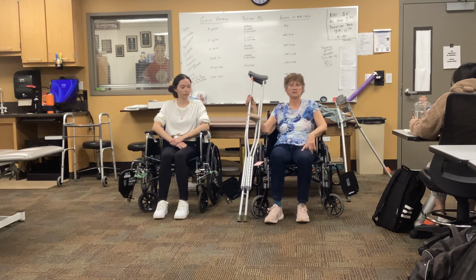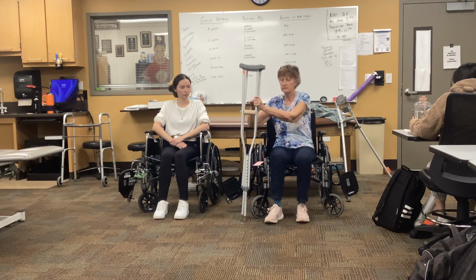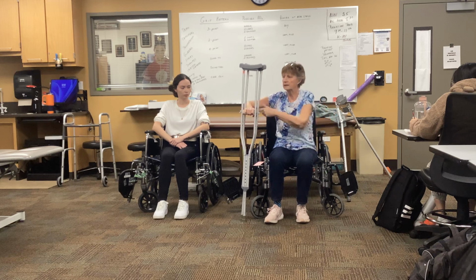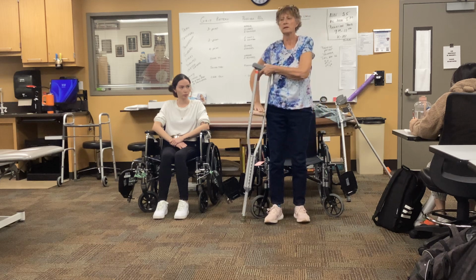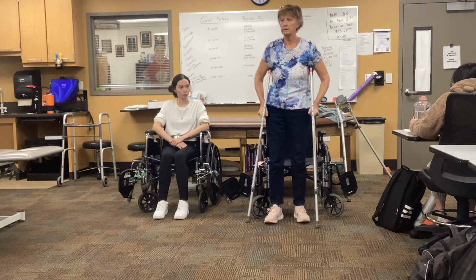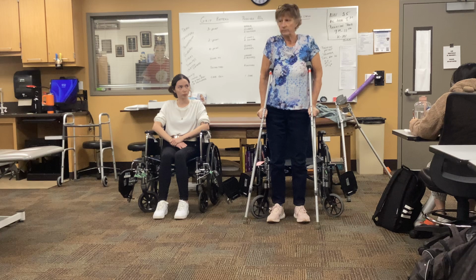Okay. So I'm going to demonstrate. Same thing, slide to the edge of the chair, one hand here, pushing down, not pulling, pushing off the chair, putting the outside crutch underneath, and turning them so they're both under their arms. Full weight bearing.